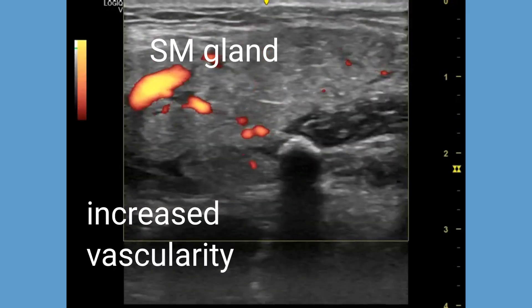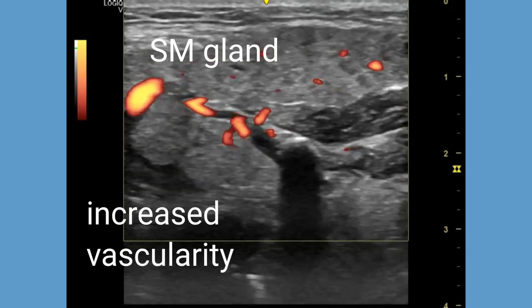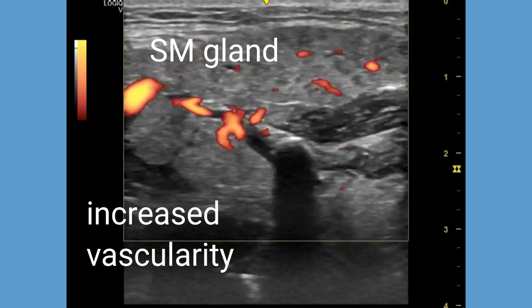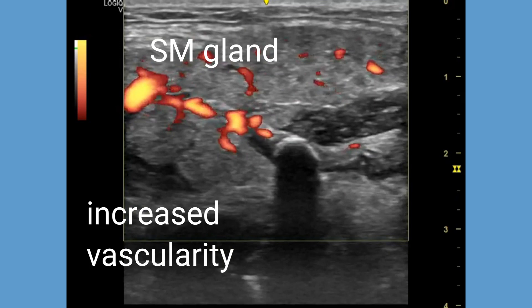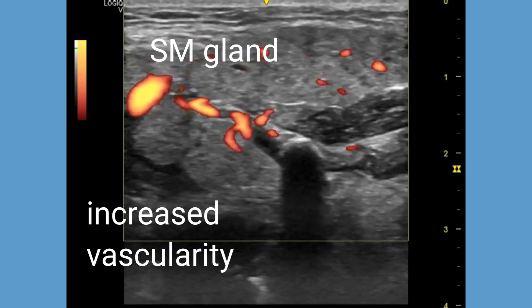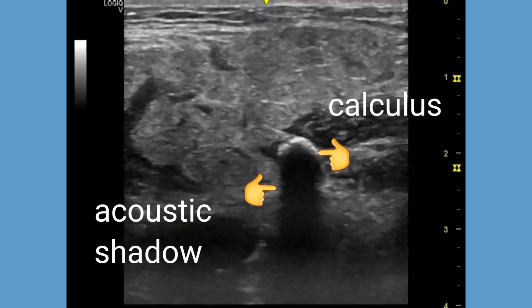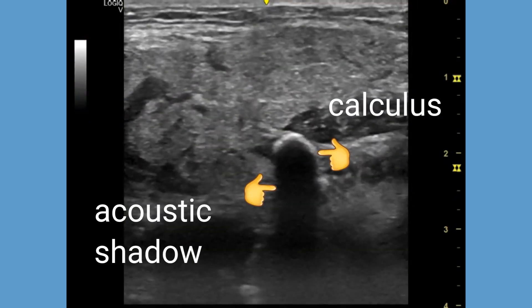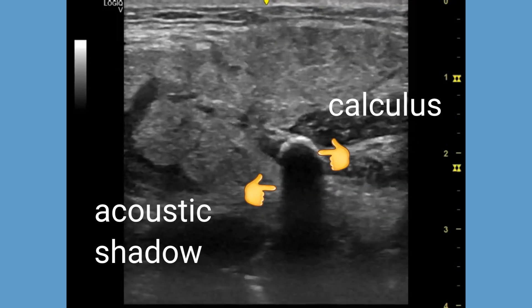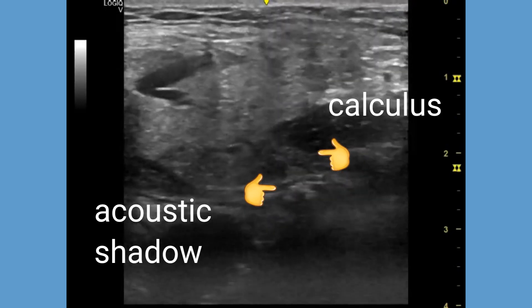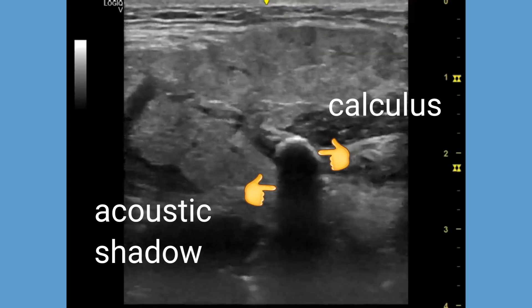Colour Doppler ultrasound shows increased vascularity of the gland, which means there is more blood flow to the inflamed salivary gland tissue. Ultrasound also shows obstructive changes in the gland such as dilation of the duct, enlargement of the gland, and an accumulation of fluid or pus within the gland.